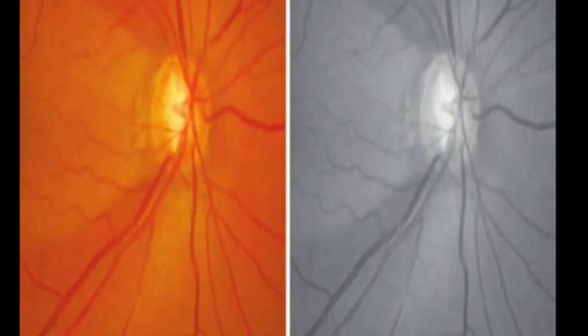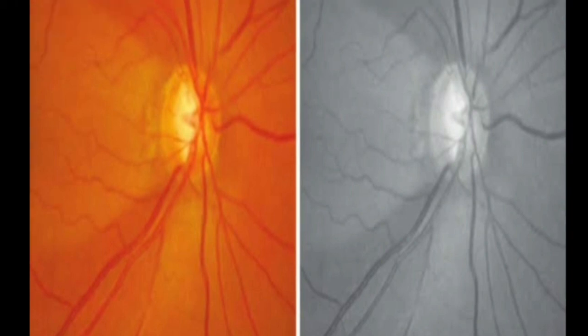This defect in the retinal nerve fiber layer highly correlates with the visual field changes, the neuroretinal rim area, and even the fluorescein filling defects. These defects can be diffuse or generalized loss of the retinal nerve fiber, or it can be sectoral as is shown in this picture.